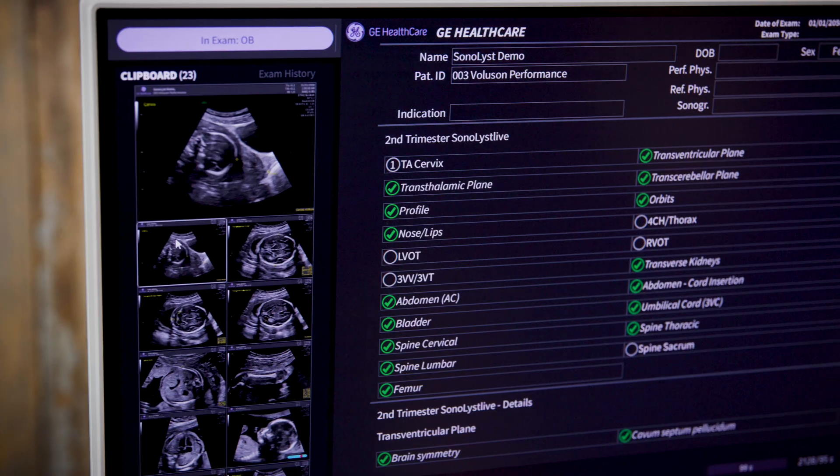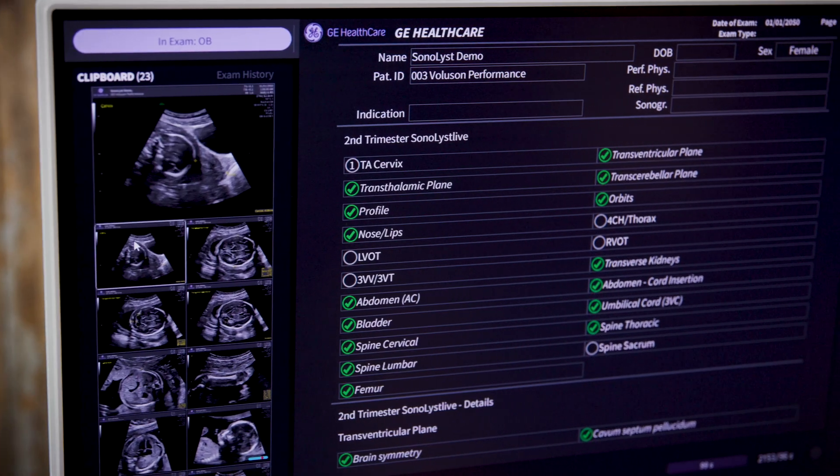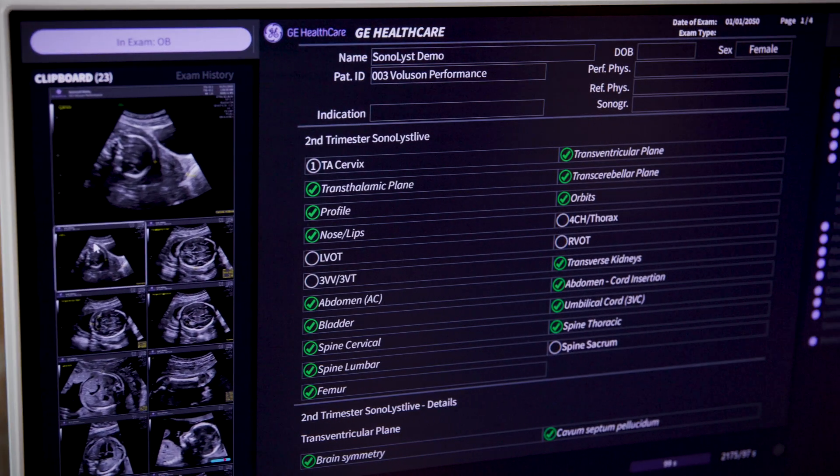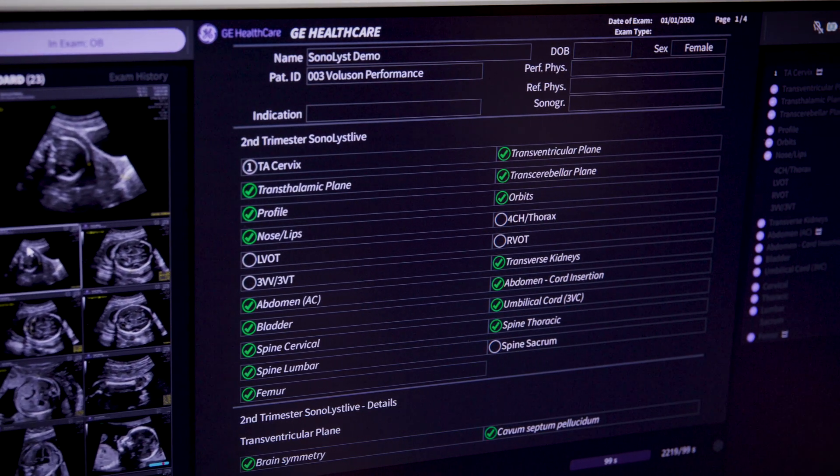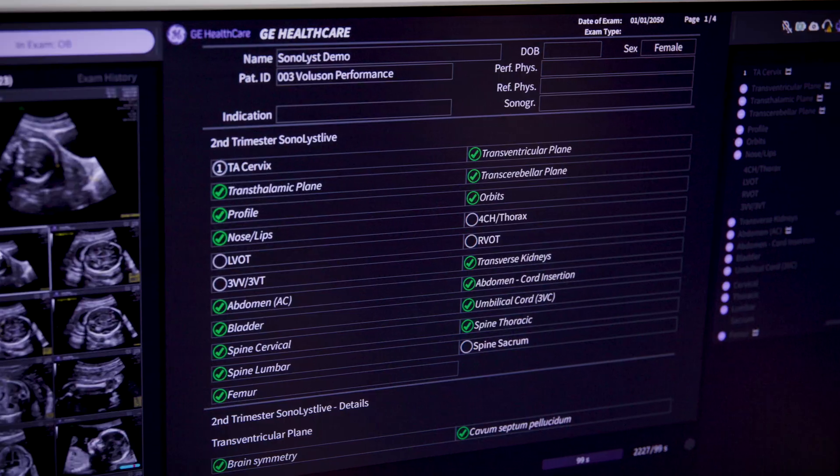No matter which method you use, when you press End Exam, you'll get a checklist summary so you can review everything before finalizing. Sonalist Live is all about giving you options. Whether you want a little help or a lot, it's here to make your day easier, more productive, and to give you peace of mind knowing AI has your back.